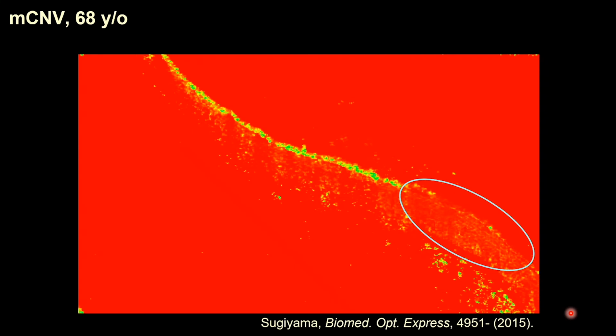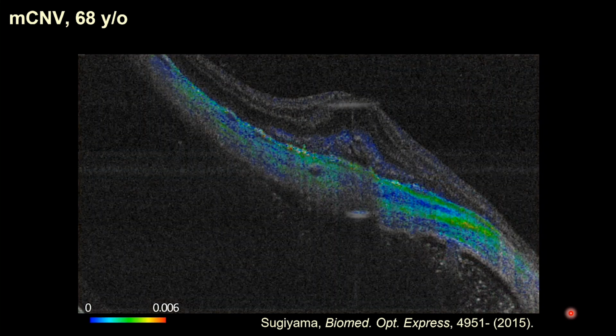By turning on the birefringence imaging, we see a moderate birefringence in the sclera here, right? The green. That has already been known. But by watching it, we can find another layer here. It's a low birefringence, blue.